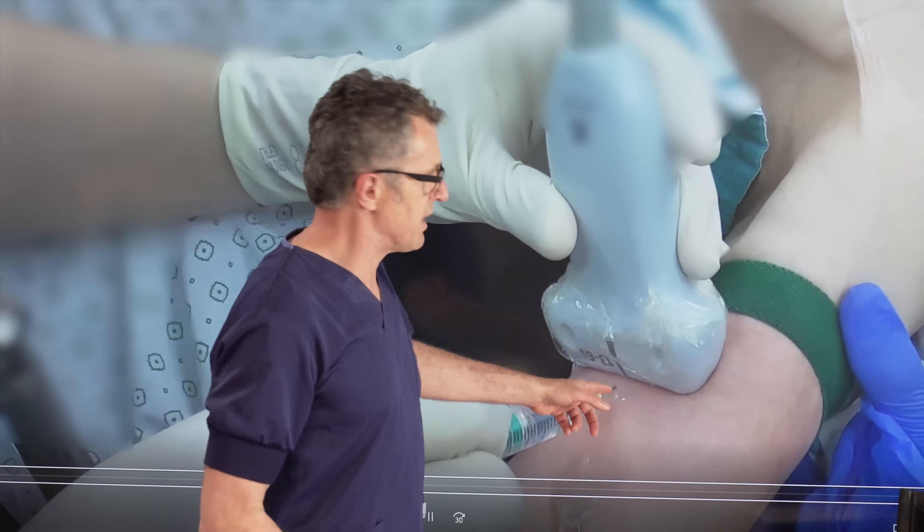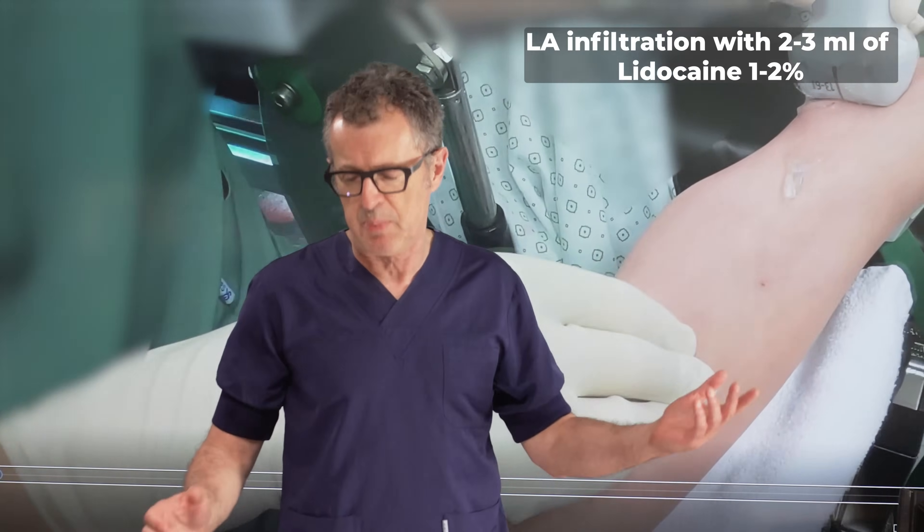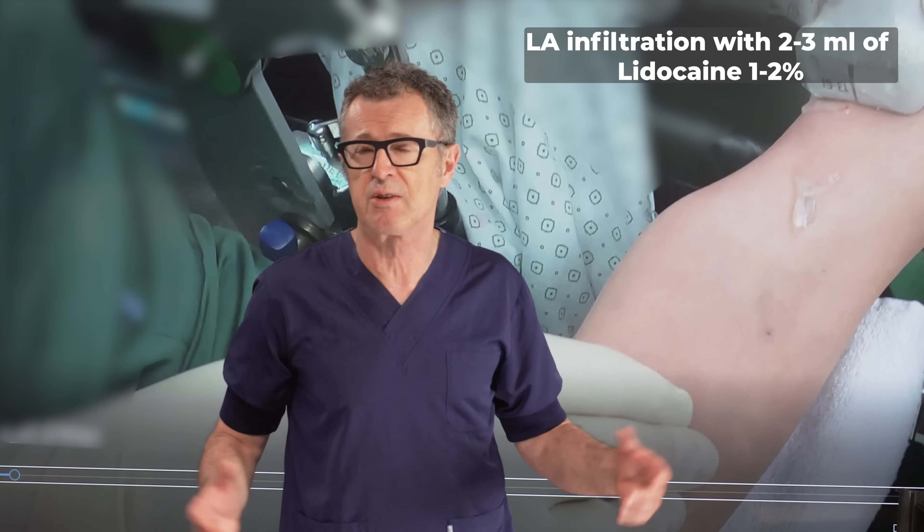Here we're going to infiltrate the skin with local anesthetic, typically about 2% lidocaine, 2 or 3 milliliters. That really makes it a lot more pleasant and easier to perform the procedure.